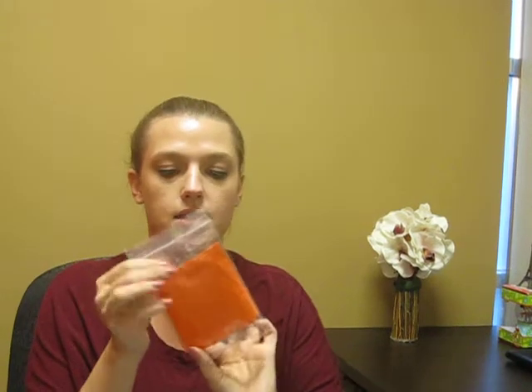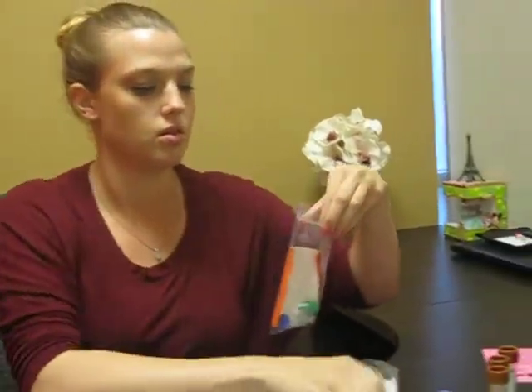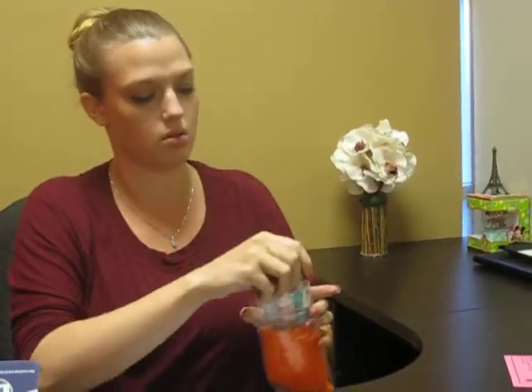Make sure all the caps are tight and put them all back into the box when you're done. They all come in little baggies like this, which have a little moisture catcher. So you're just going to make sure you put all your tubes back into the bag. Put this back in the box that we gave you, along with this. And all your stool samples also go in a bag and back into the box.